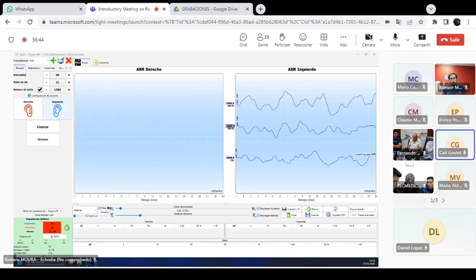These are functional ranges. They're not specific to the tests. What I understand is that the Commission wants to see that the equipment can actually reach those decibel levels. But it doesn't make sense because it's in the documentation, so they'll have to accept what's in the documentation.